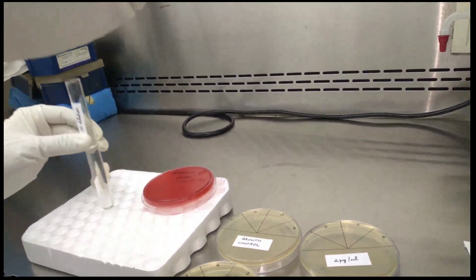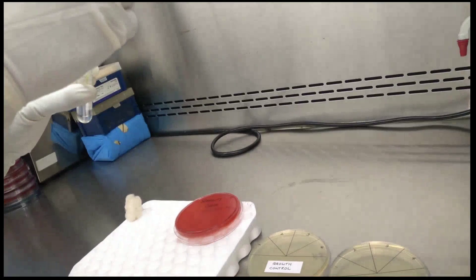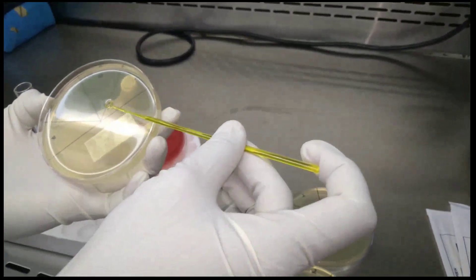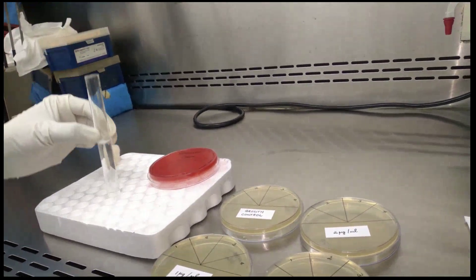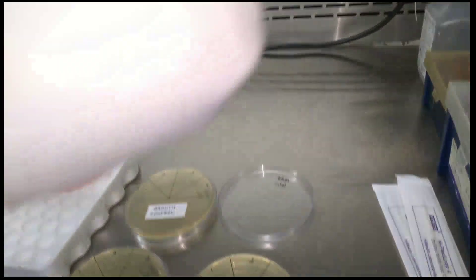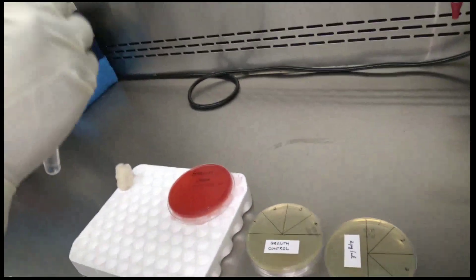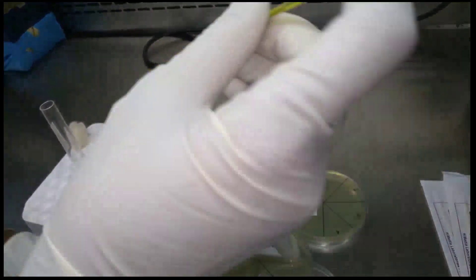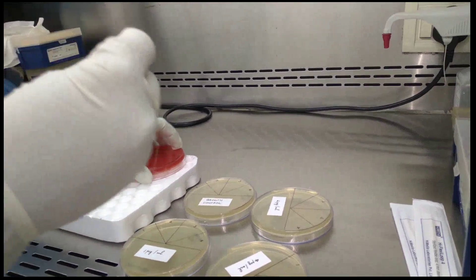Take a 10 microlitre loop and streak it in the area corresponding to the isolate number. Take a loopful and streak onto each colistin agar plate — first the growth control plate, then the 1 microgram per ml plate, the 2 microgram per ml plate, and finally the 4 microgram per ml plate. Do not forget to subculture onto a blood agar plate as a sterility check to confirm the purity of the isolate.